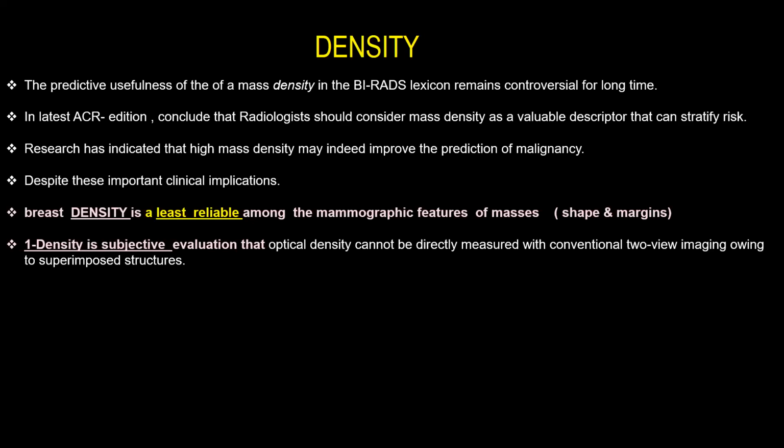Some of you might say this is high, this is low, like that. It is subjective, not measurable. It is not measured by computer, because the 2D and overlapping breast tissue hinder that measurement. But there is a suggestion that on tomosynthesis the density might be measured, or the optical density might be calculated.